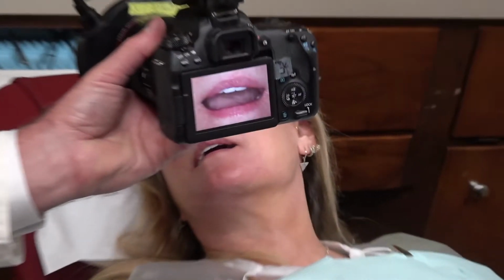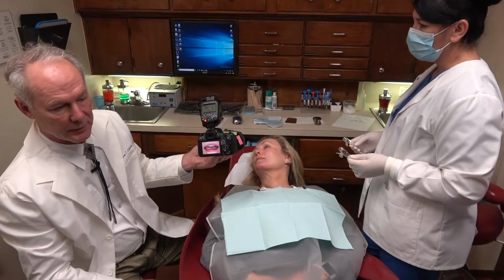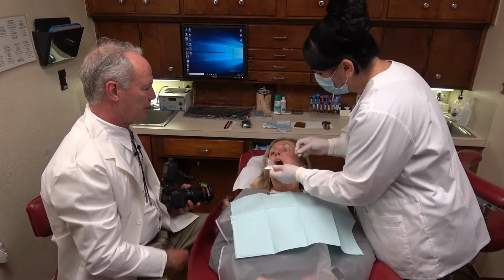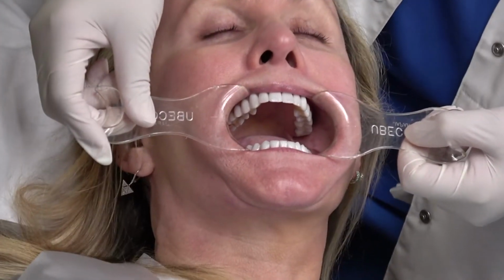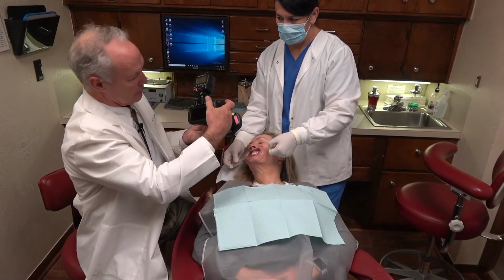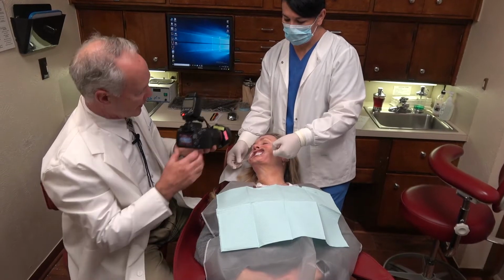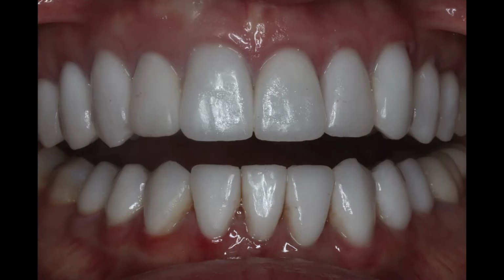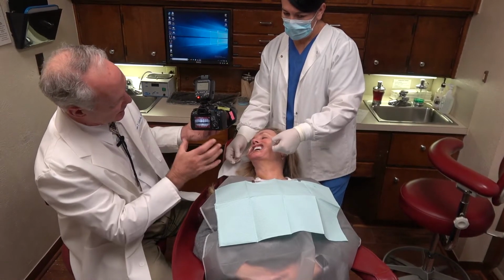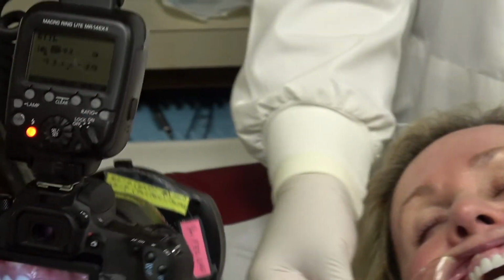This is showing lips in repose. Remember, you always want to have some tooth display with the lips in repose. Now, Louisa, would you place those retractors, please? Now bite down all the way, please, and turn my way. That's the teeth together. Now open just a little bit, please. That's the teeth apart. Notice I don't have a lot of lips in there. You want to hone in on the part that you're interested in.